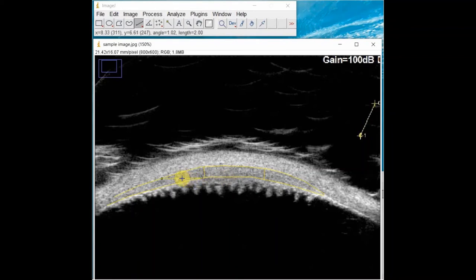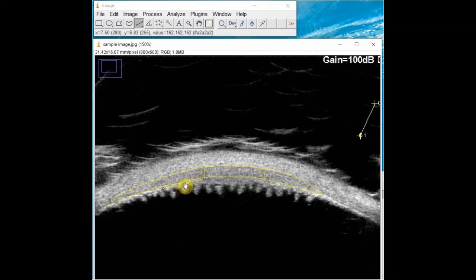Next, move your two millimeter line to the left of center, preferably to a location where there are no overlapping ciliary processes from the previous measurement. If the image quality is poor such that there is no location to the left with well-visualized ciliary processes that would not overlap with the previously measured ones, then the new location may have overlapping ciliary processes. Repeat the count and record the new measurement. Then move the two millimeter line to the right and repeat. This parameter is measured by taking the average of the counts at each of the three locations.